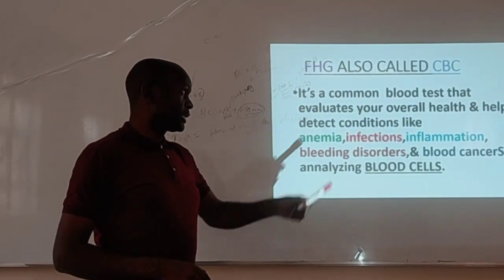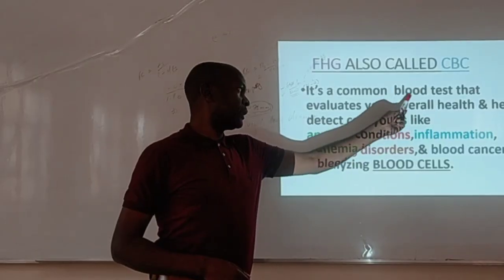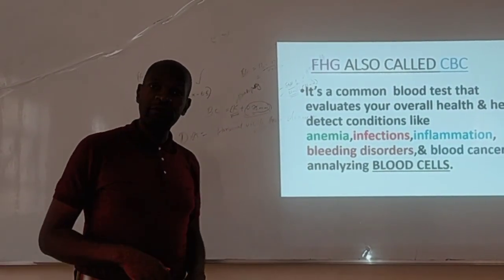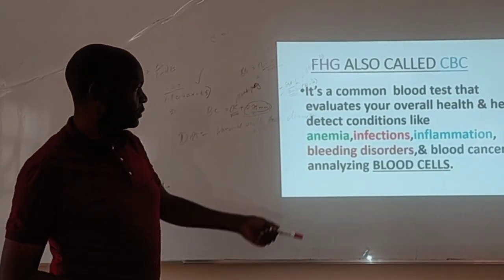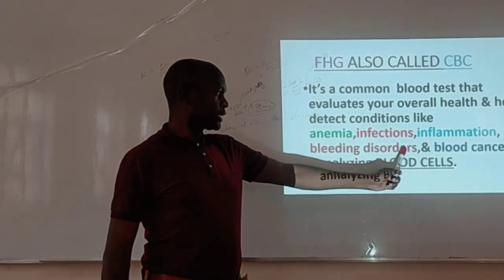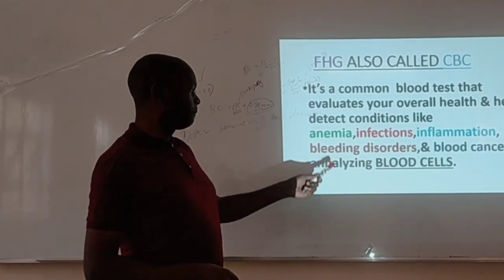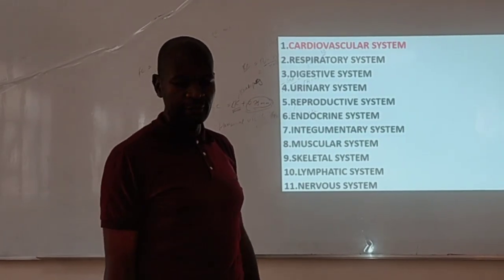So it's a common test, as you can see, and its function is to evaluate the overall health of a patient, and therefore helping the doctors to detect a number of conditions such as anemia, infections, inflammation, bleeding disorders, and blood cancers, among others. So it analyzes the blood cells.